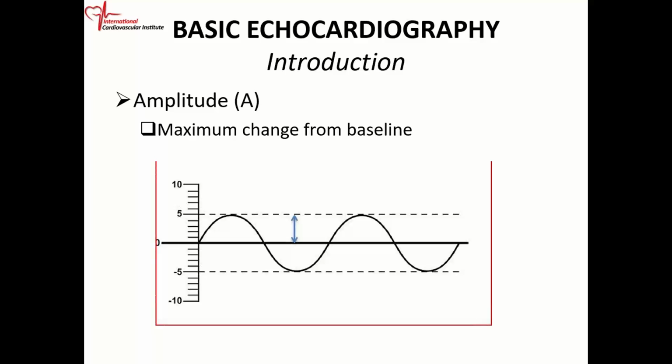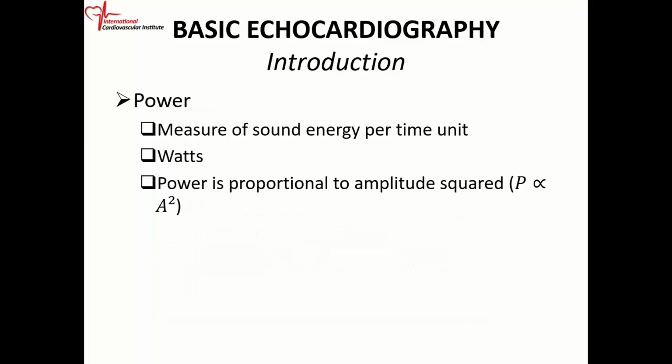And you will see the importance of this physics when you start doing ultrasound, because when we talk about power, it is the measure of the sound energy per unit time. So power is just the energy per unit time, how long you supply that energy.